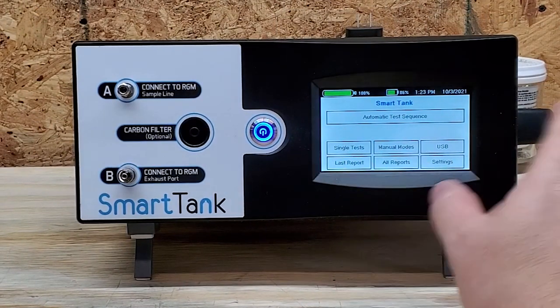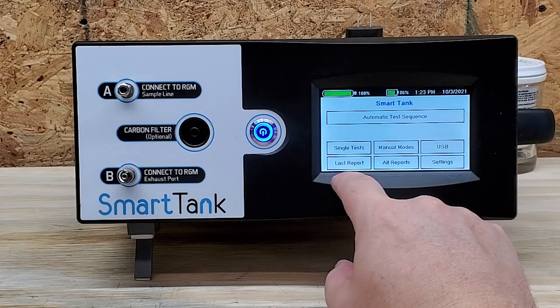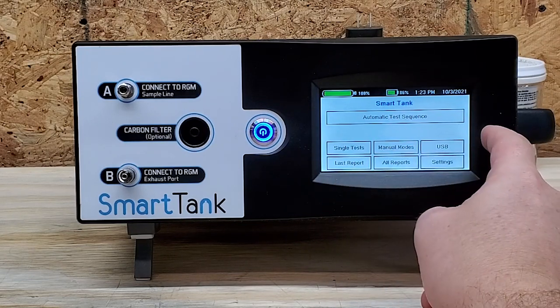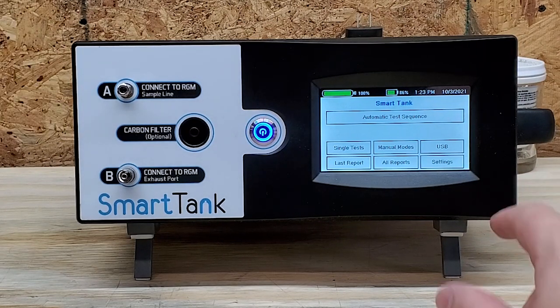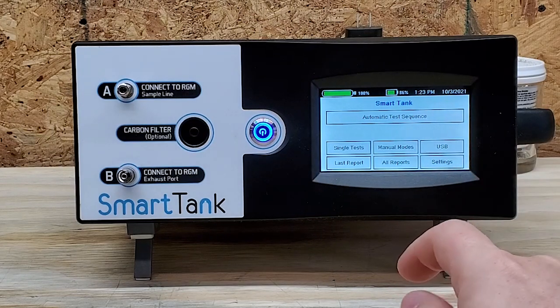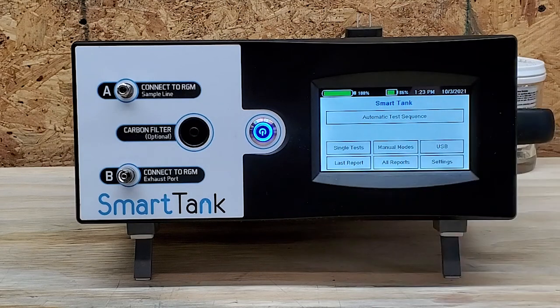We're right into the first menu. You see there's Automatic Test Sequence, Single Tests, Last Report, Manual Modes, All Reports, USB, and Settings. One of the things the crew at Smart Tank told me is that this device you can update yourself — I assume that's what the USB is for. You just plug in your USB with your new models or new test sequences and it'll upload them to the device.